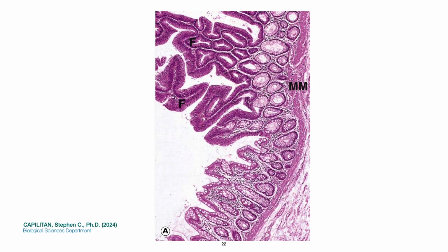In growth characteristics of surface neoplasms in the colon, this is a benign neoplasm, a villous adenoma, in low power. It shows one form of a benign colonic neoplasm. This villous adenoma has grown into the lumen in the form of papillary fronds, in letter F, with a stromal core covered by moderately dysplastic epithelial cells. The underlying muscularis mucosa, in letter MM, is intact, and there is no downward tumor spread.